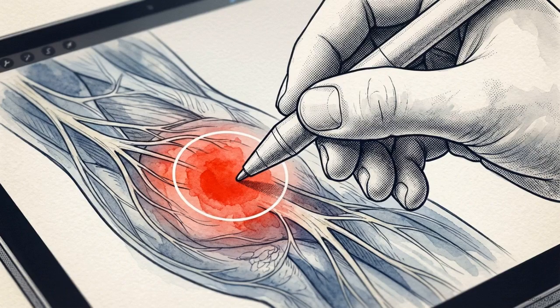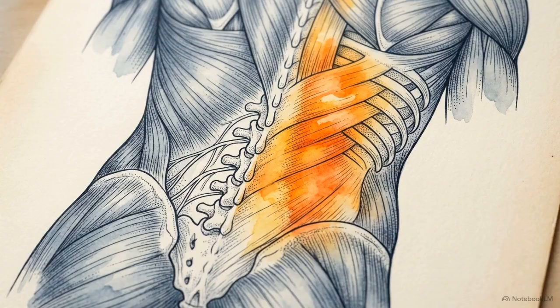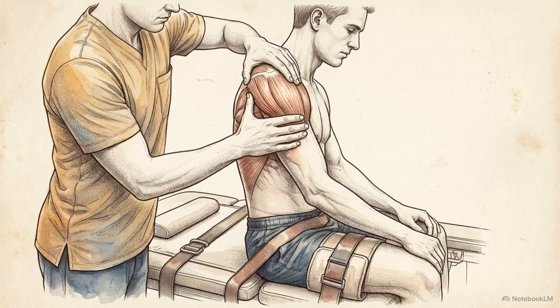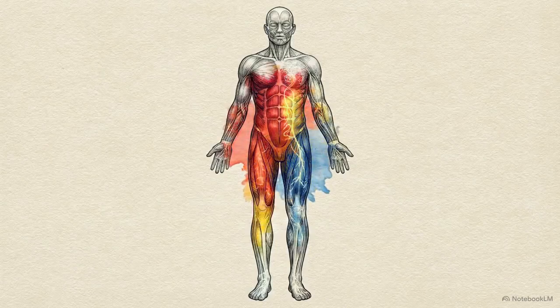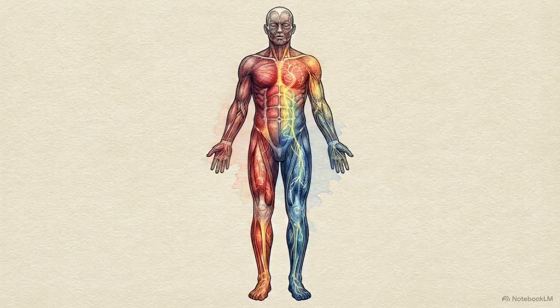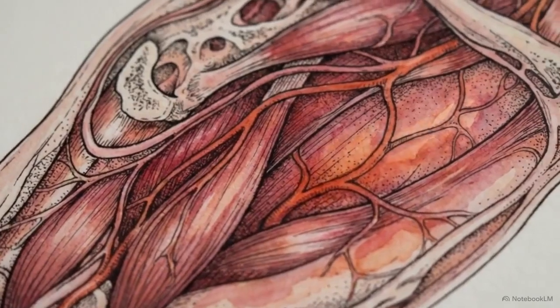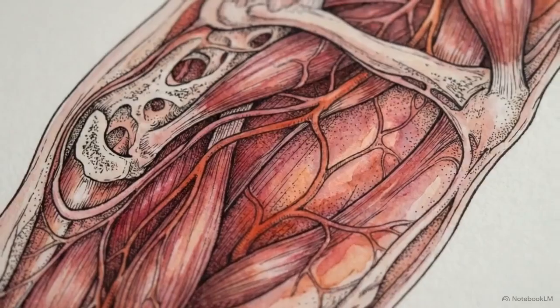By isolating and interpreting these thermal deviations, clinicians can pinpoint subclinical inflammation, map compensatory muscle fatigue, and quantify the body's response to mechanical interventions as they happen. The thermogram acts as a direct, real-time readout of the body's functional pathophysiological state, capturing activity that standard structural imaging misses entirely. This animation shows the internal biological trigger that generates a thermal scan, starting deep within the musculoskeletal system at the site of a microinjury.